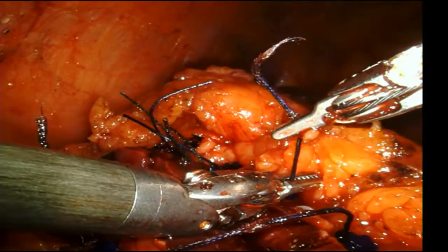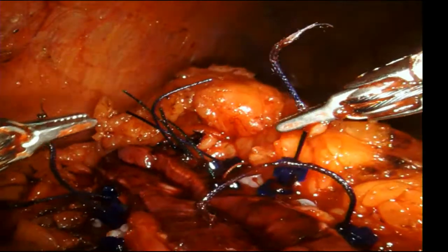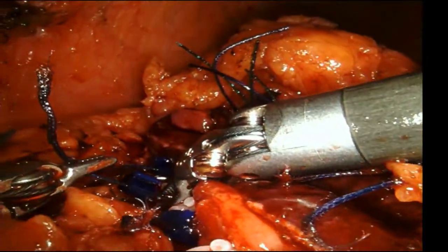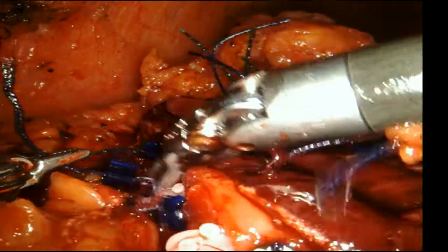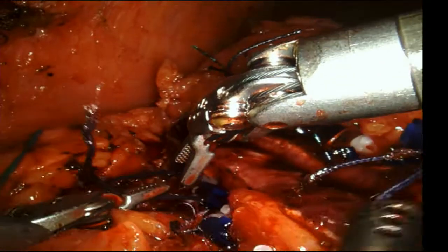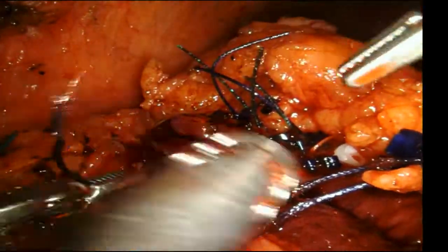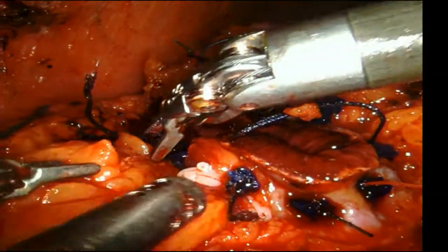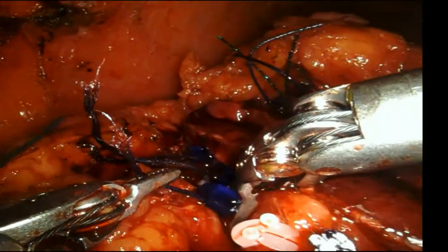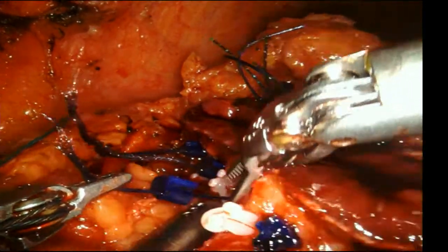Yeah, initially I was concerned about the depth too. And then I realized that my deep layer is deeper than I think. You know what I mean? My deep layer is actually a lot deeper than we think it is. So I think you're right, Ronnie, in that it is analogous when you put these stitches straight across. It's pretty analogous to your initial layer that you put in. That's the goal. That's what I'm trying to achieve, basically. And then now I'm cranking the hell out of it.